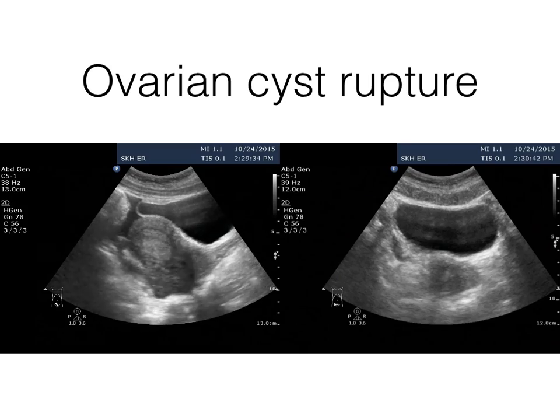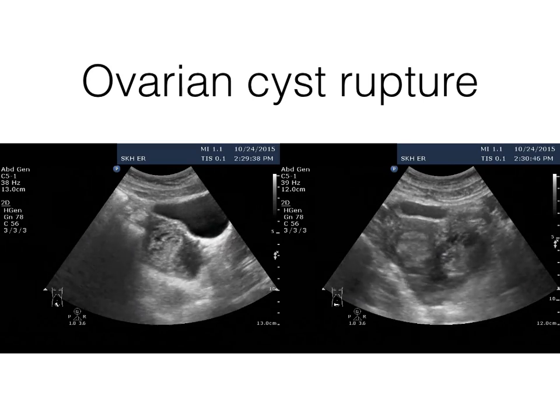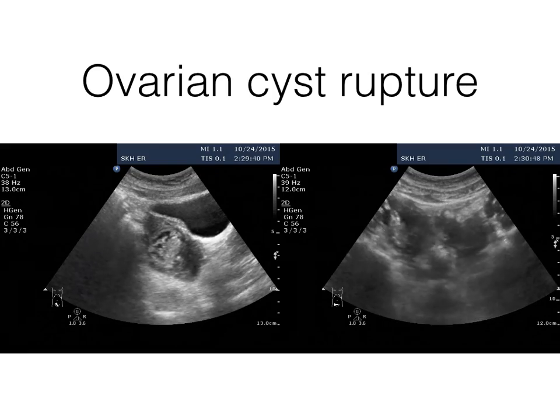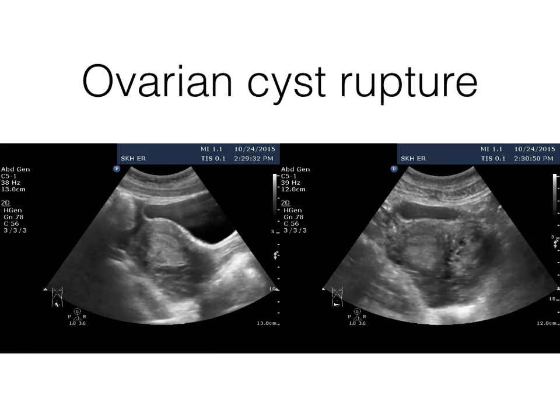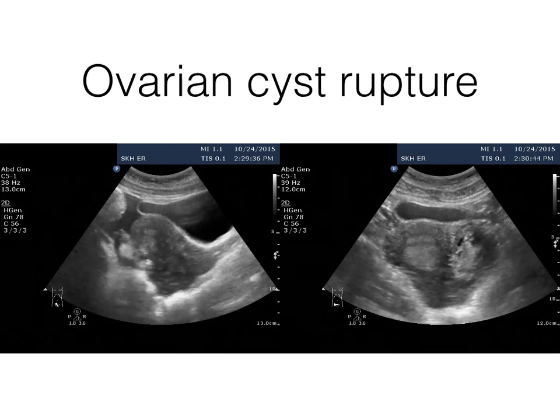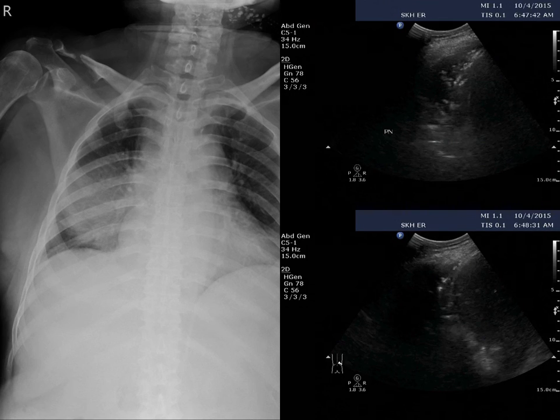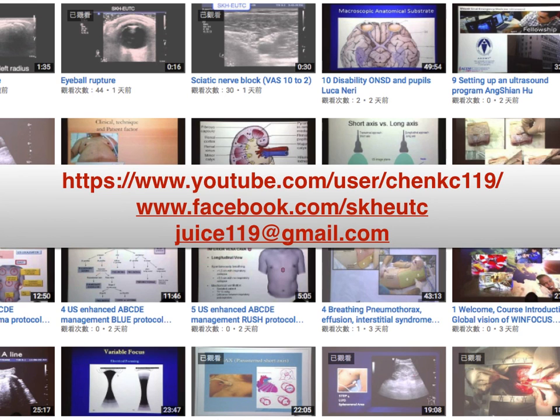Fluid. And transversely, for the teenage girl, a ruptured ovarian cyst. But first, confirm there is nothing inside, check the pregnancy status, then make the diagnosis. Okay.